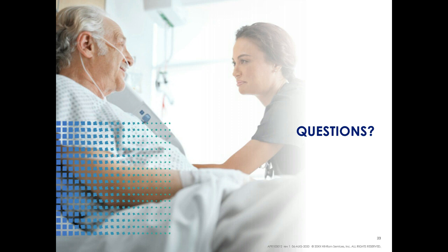Sure, great question. We actually hear this question quite a bit. It's Tiffany again. We see end-tidal CO2 monitoring being used to safely manage patients receiving opioid pain medications, tying to that potential of unexpected respiratory compromise resulting from the effects of those pain management therapies, which the Joint Commission had outlined in their Sentinel Alert on the safe use of opioids several years ago.